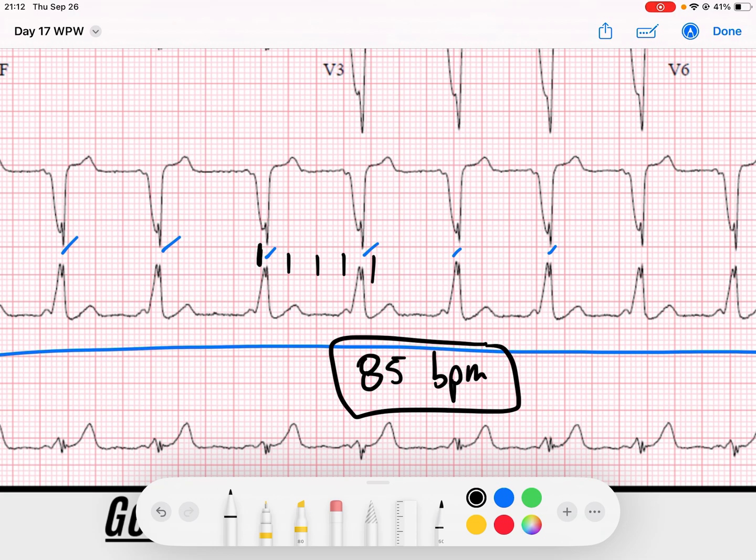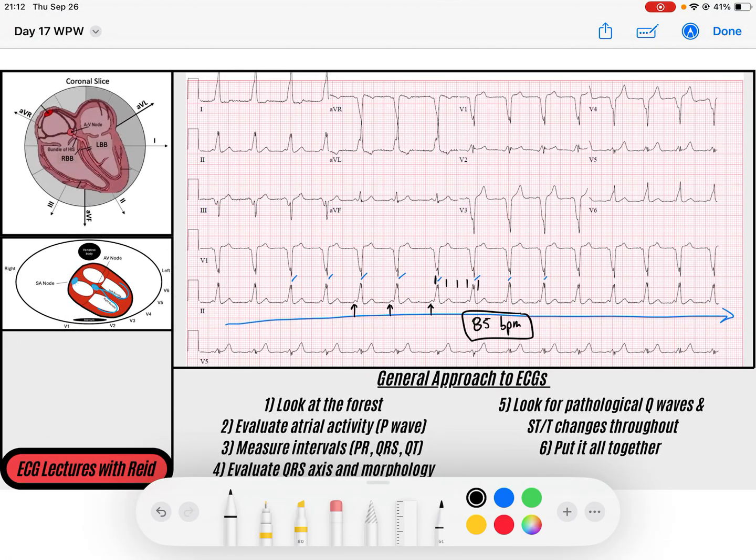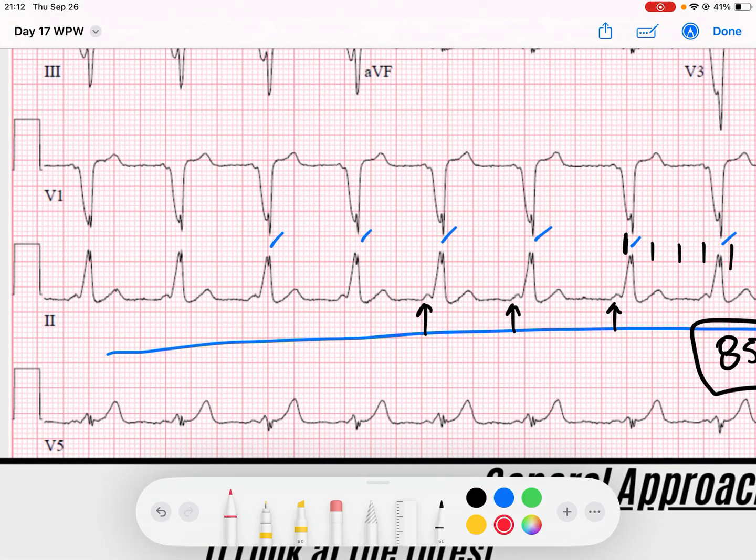I noticed that there are P waves in front of my QRS complexes. So this rhythm seems to be driven by some type of atrial activity. But my QRS is wide. I do look at my QRS complex and I see that I've got a wide QRS. My QRS complex is greater than 120 milliseconds.